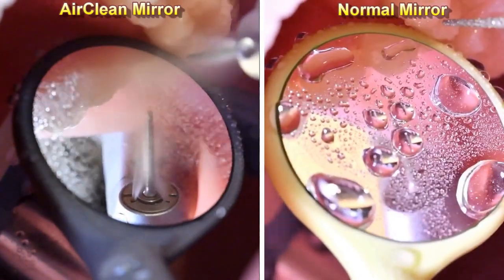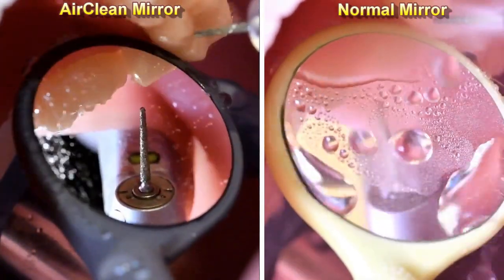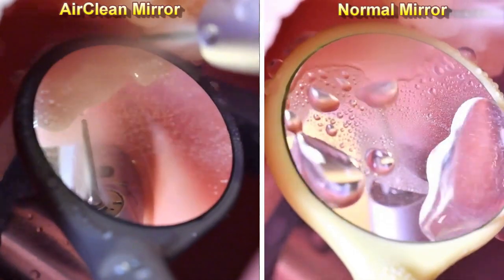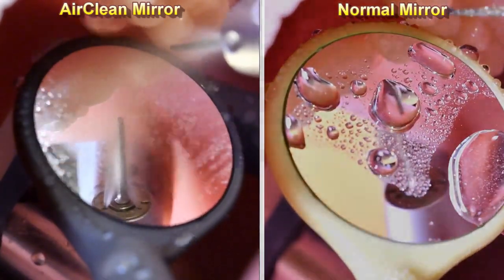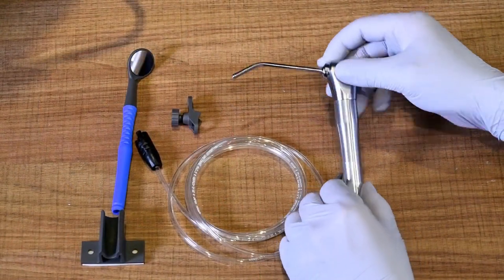On the left is our air clean mirror, and on the right is a conventional mirror. You can see the constant airflow keeps a clean lens during clinical work. It is installed easily with two different methods.